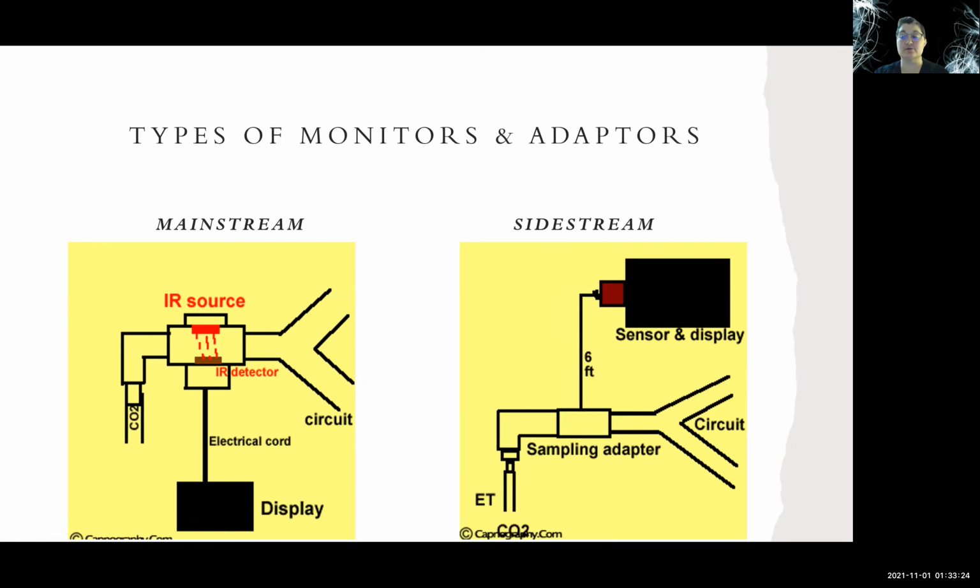That's because the tube could be in the esophagus, or the circulation isn't bringing enough CO2 to the lungs. So ultimately, in non-arrest patients, this device is actually going to be 100% sensitive, while in about 69% of patients with cardiac arrest, it will be helpful.